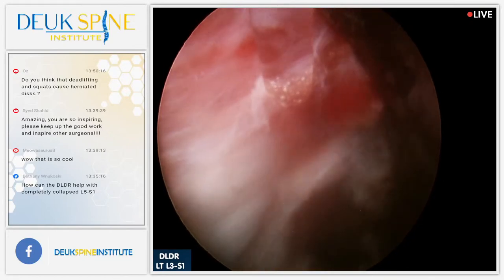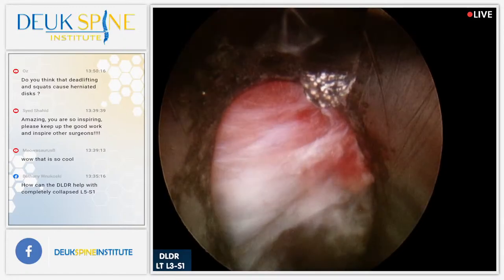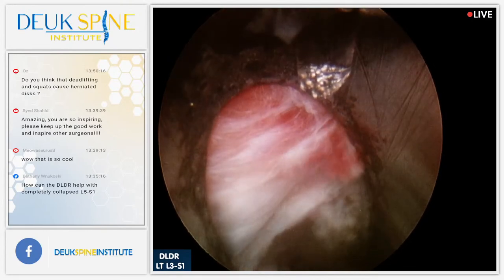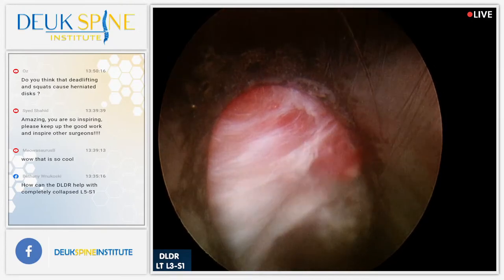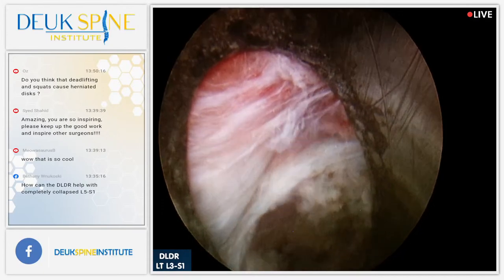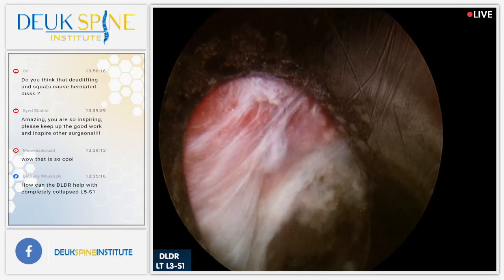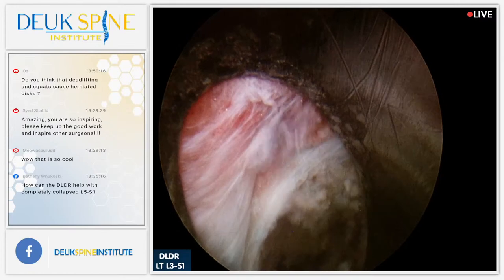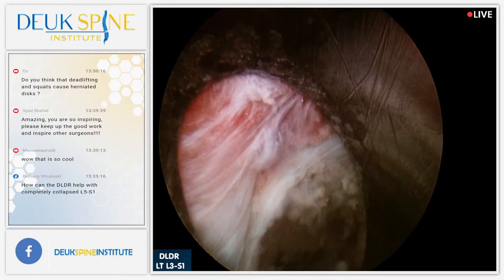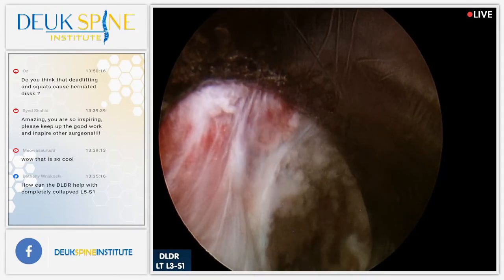All right, there's the other nerve root. Today is a beautiful day for nerve roots. Look at that. Normally we don't get to see that. Might as well take a quick picture there. Give me one more second, I'll use the grabber and get a better picture because we had a femoral. Right now, Henry. And let me turn down the irrigation. I got it. All right, cool. Thank you. All done. I think we're done.